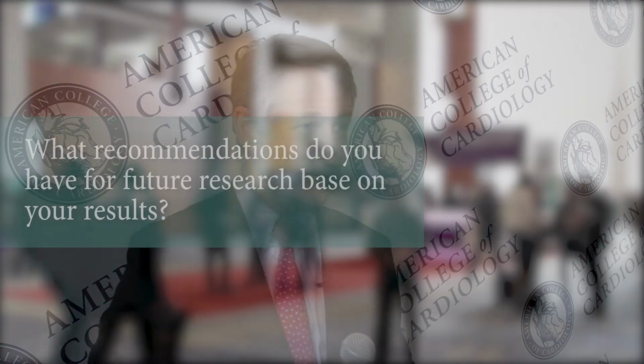We also noticed that the US valve guidelines came out, and TAVR is now a 2A indication for intermediate risk. That's because there was one trial. Now there's two very strong trials. The next time they do this, TAVR for intermediate risk is going to be a Class 1 indication. In the short time that TAVR has been here, it's amazing it's reached Class 1.